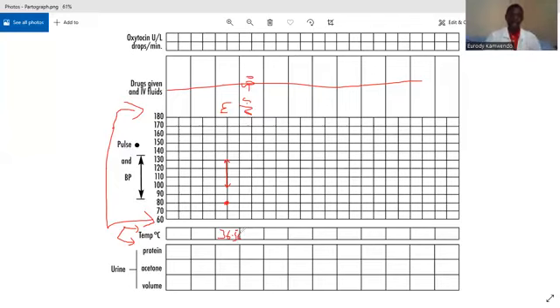So you record it in that particular box. But you'll find that in certain Partographs, you also record the temperature here, meaning you use different pens, because for temperature you use dots, and then you join the dots like that to give you a particular curve as you continue checking the temperature.